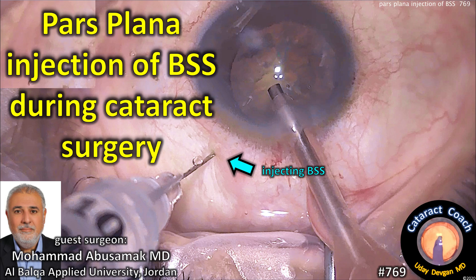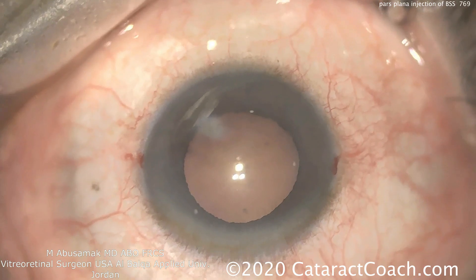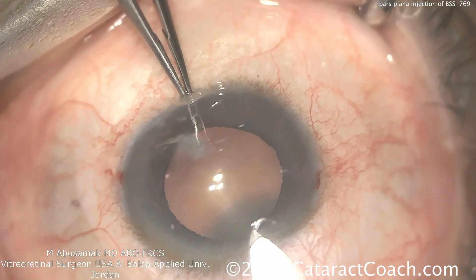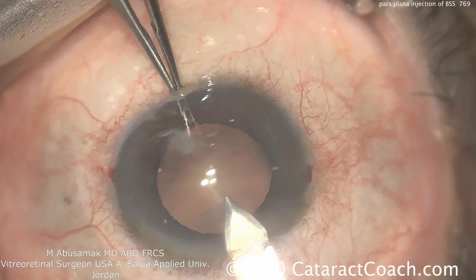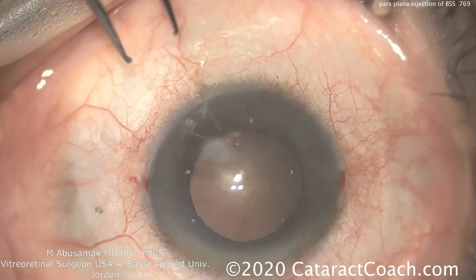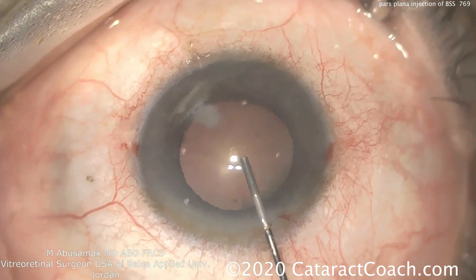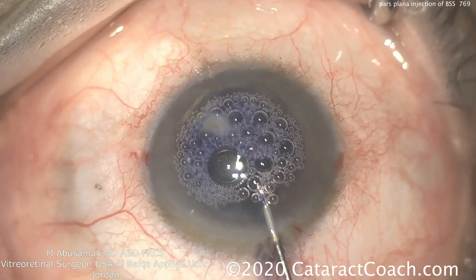CataractCoach.com. This video covers pars plana injection of BSS during cataract surgery, and our guest surgeon is Dr. Mohamed Abusamak from Jordan. Here's the patient who's monocular and highly myopic, making a good phaco incision. That looks fine. You can also see that there's a corneal scar or opacity just away from the visual axis.